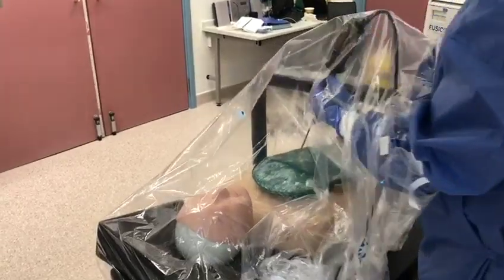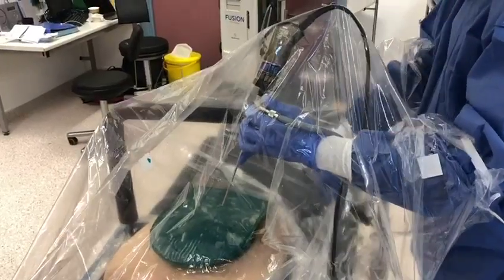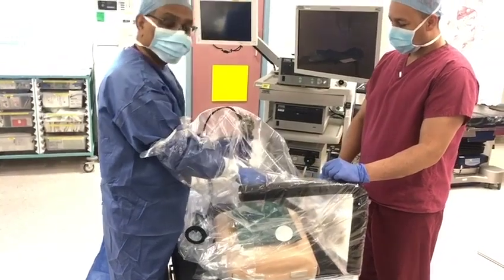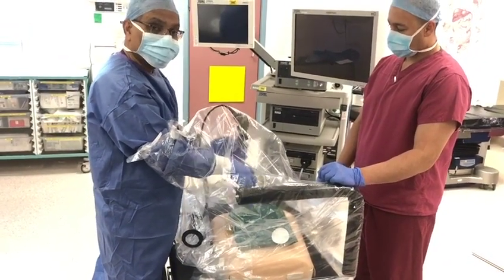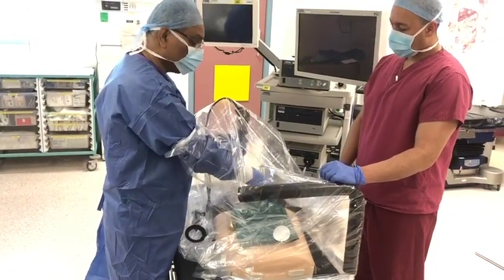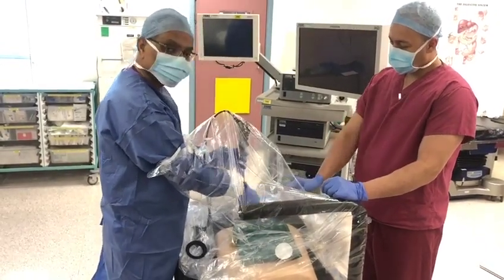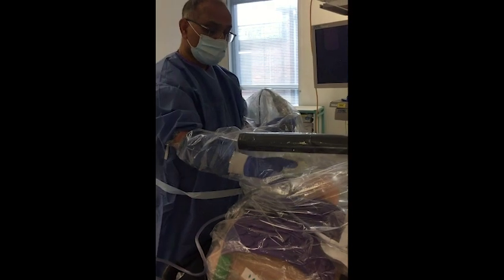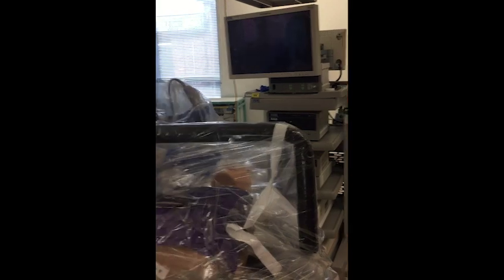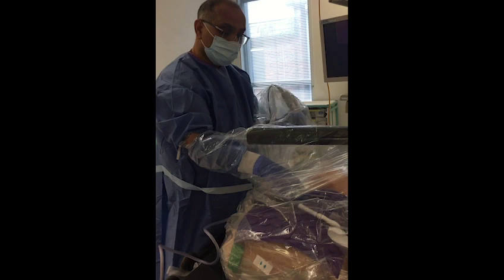There is another rack over on the drape. Most of the time I'll be picking up my own instruments and using them. However, if I require any assistance, my nursing scrub assistant can still pick up instruments externally and hand them over to me — that is still possible. For example, if I want a suction, they can pick it up from outside and work through it, so you will still have a minimum level of assistance going on.